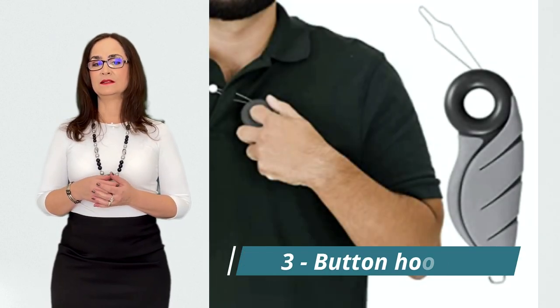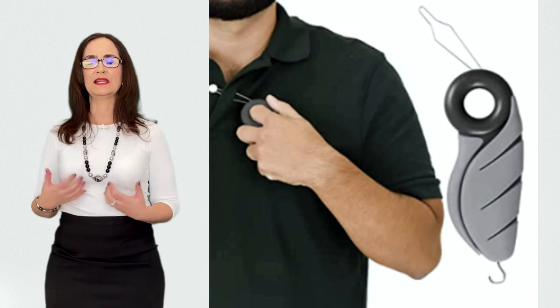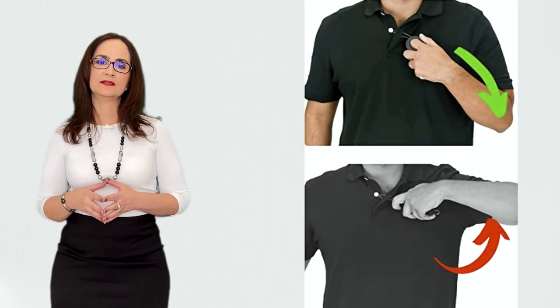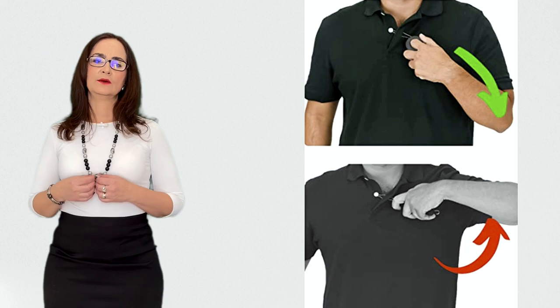Here is a button hook. This is really important if you have some shirts or pants that you love but have difficulty doing the buttons. They help you with buttons of various sizes. They take the button and slide them into the hole without you having to grab them with your fingers.